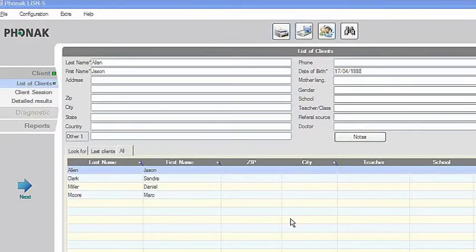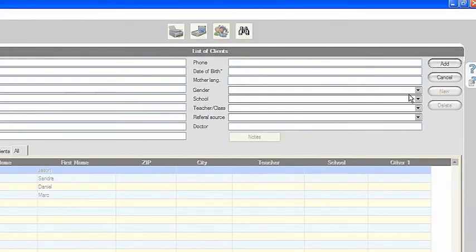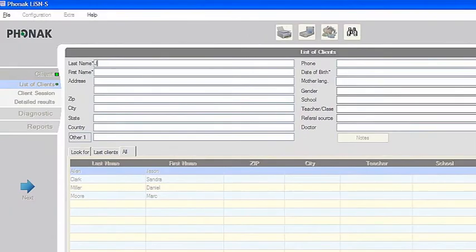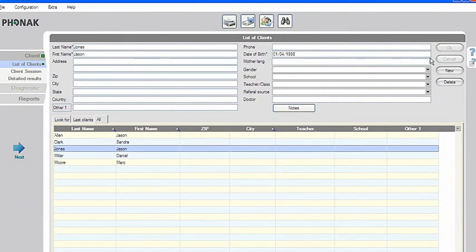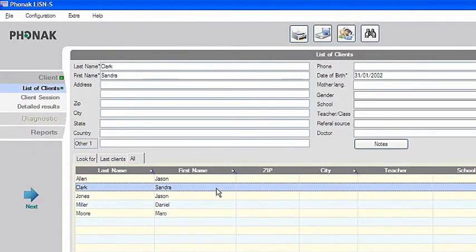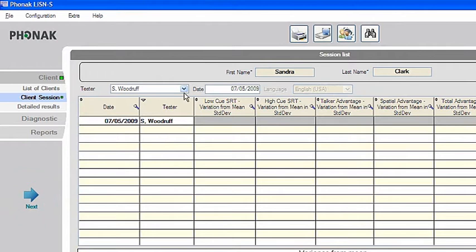First, enter new client data or select an existing client. The patient's first and last names, sex, and date of birth are all mandatory fields. All other fields are optional. By double clicking the patient row or by clicking on the right arrow, an overview of sessions appears for that individual.